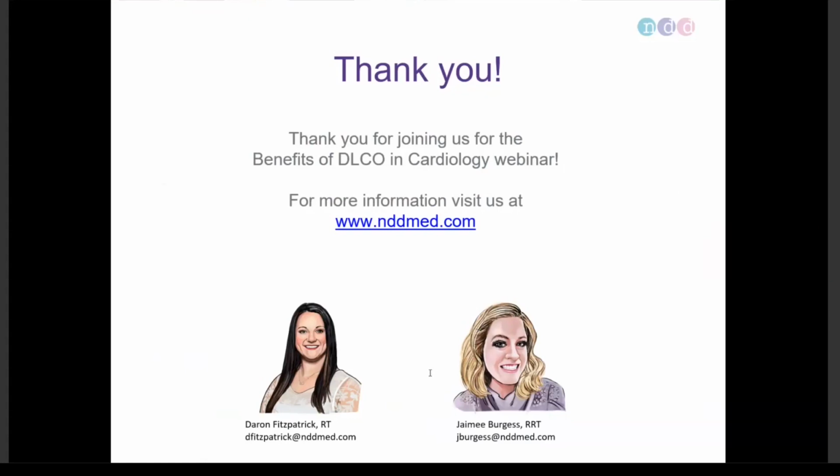I don't know if Dr. Zambito is still on or not. Do you want to add anything on that, Dr. Zambito, with amiodarone? Sure. I was responding to David as well. We didn't talk about it, but this is one of the reasons I use DLCO on all of my patients on amiodarone, to establish a baseline. The data after that is a little bit unclear, but certainly anytime there are suggestive symptoms, we'll reevaluate them.